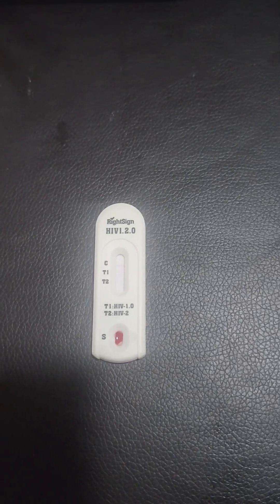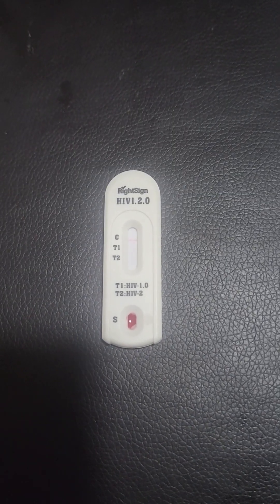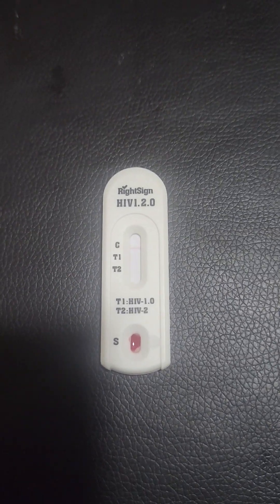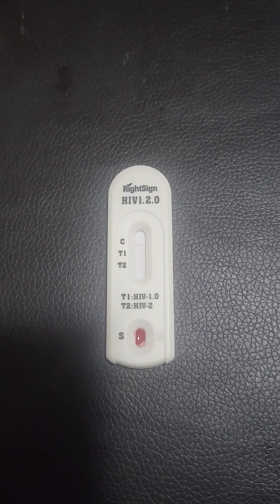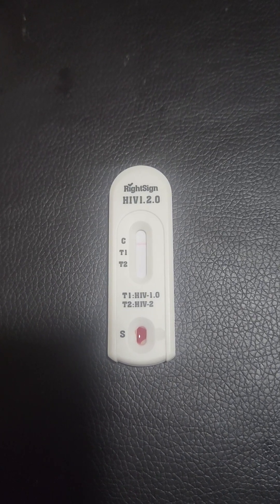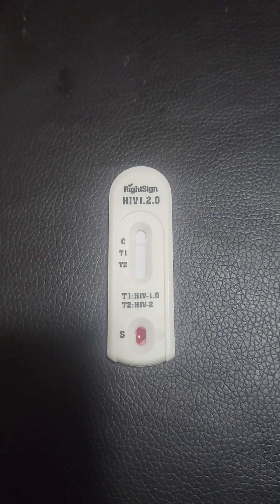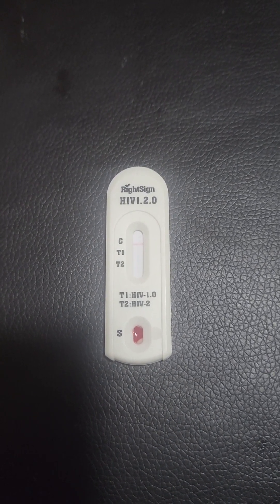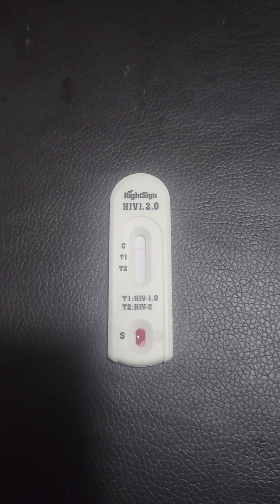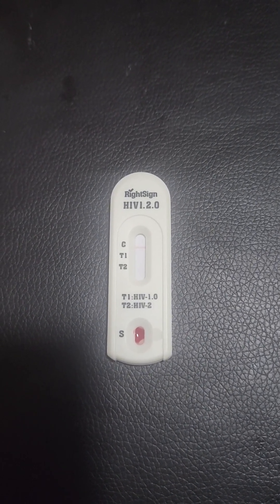After five minutes or so, you observe the test results. As you can see from these results, the visible line is along C or control — there is no line at T1 or T2 — which indicates an HIV negative test. It is to be noted that the test results are not credible after 20 minutes.